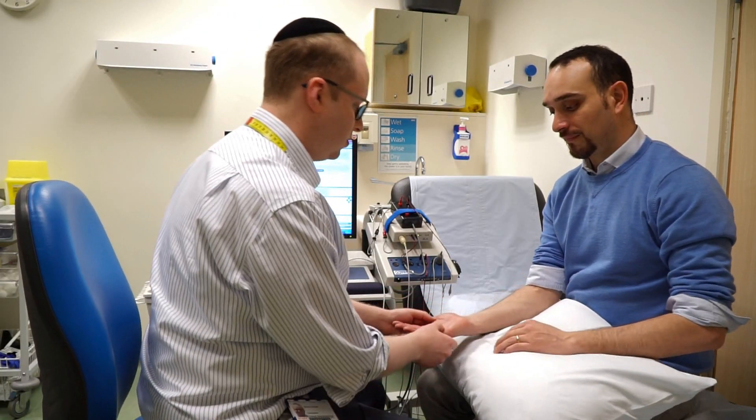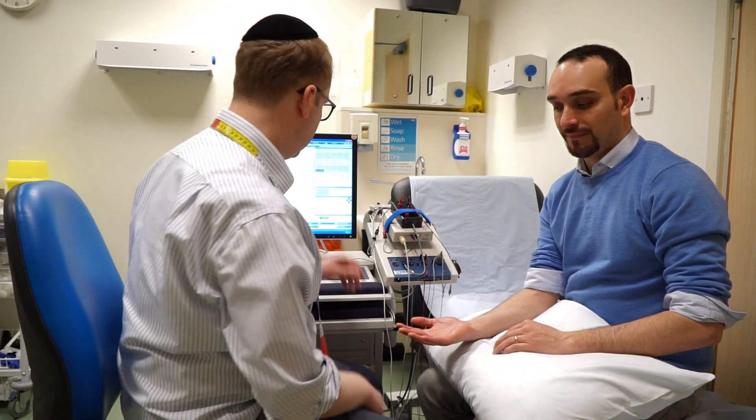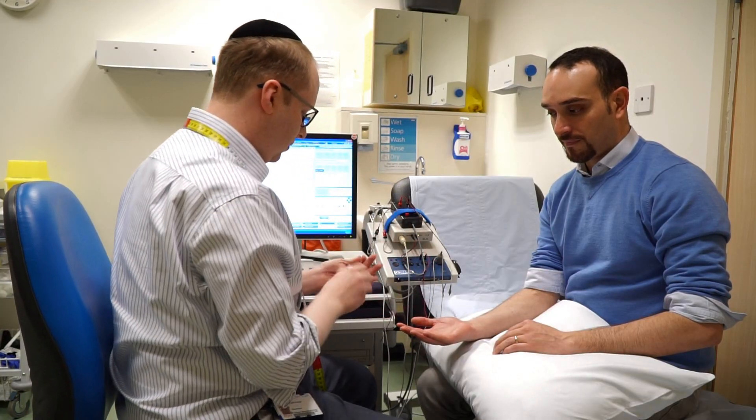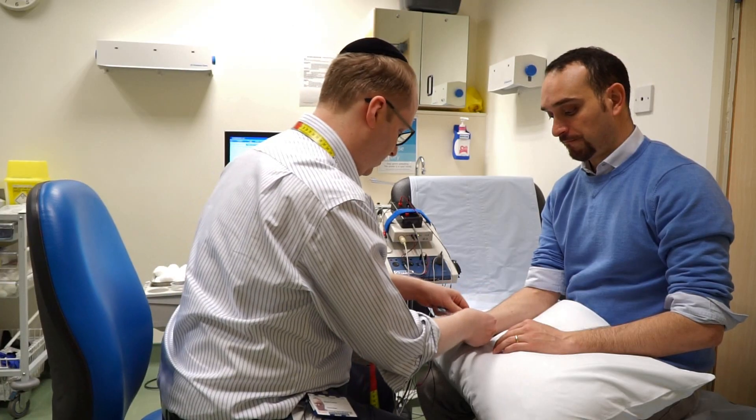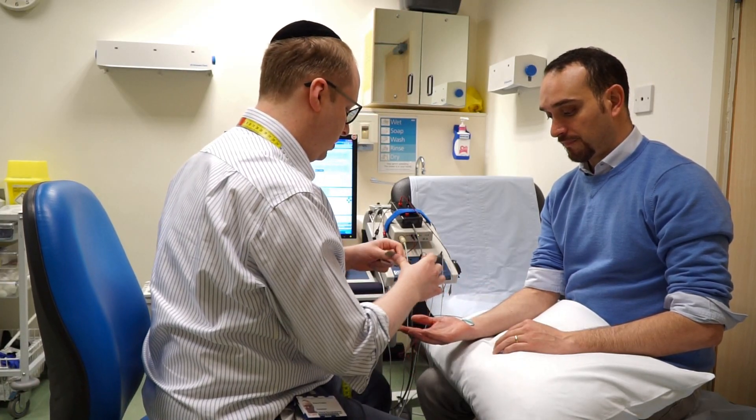So if I can just have your hand — this is Paolo, my colleague physiologist. What I'm going to be doing is putting a couple of stickers on your skin. What these do is pick up the nerve signals.